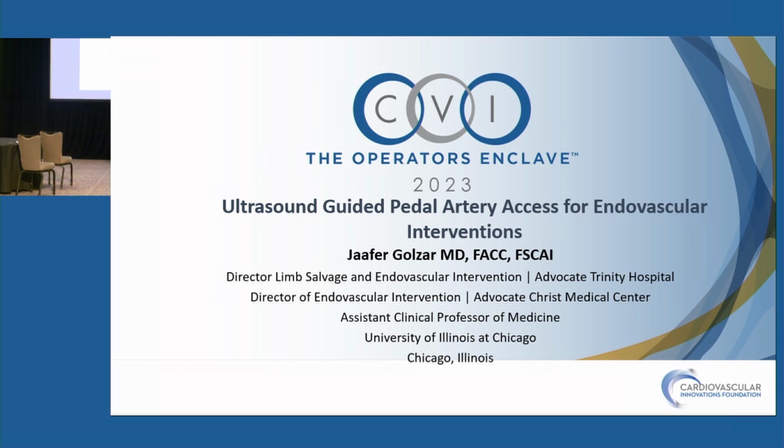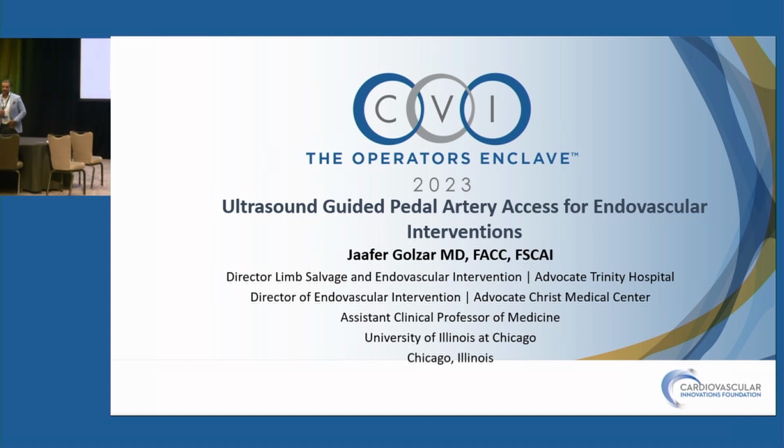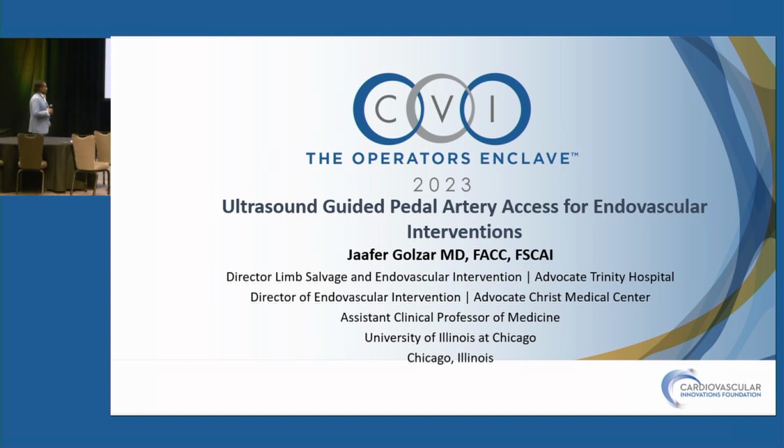So that's what we're going to be talking about today: pedal access and an algorithmic step-by-step approach, especially using ultrasound to get access. You can play a pretty intricate role with this, helping us prep the leg and helping us with the ultrasound. It's not really that hard to learn, but it is a very important tool.